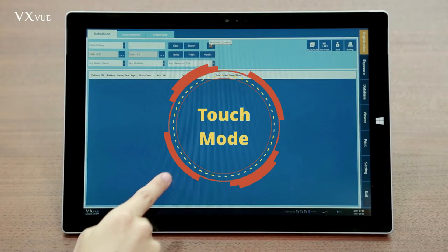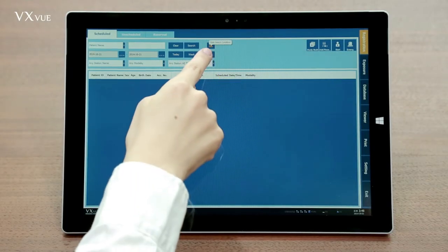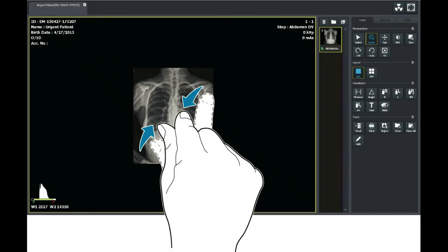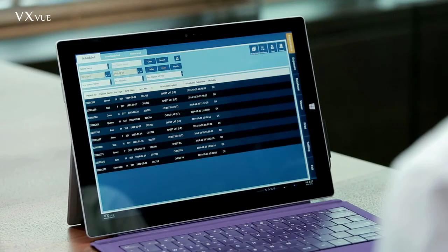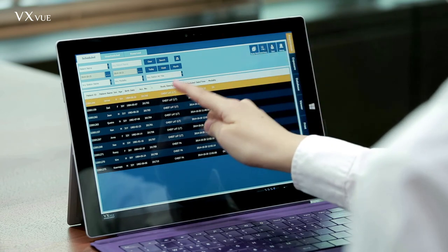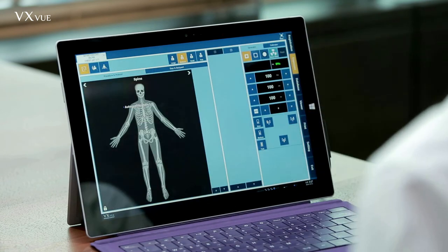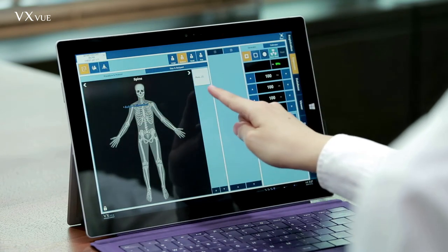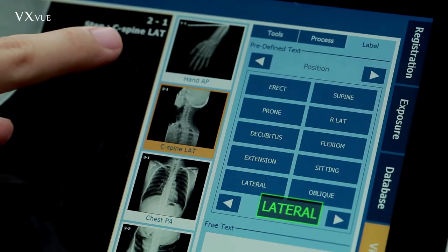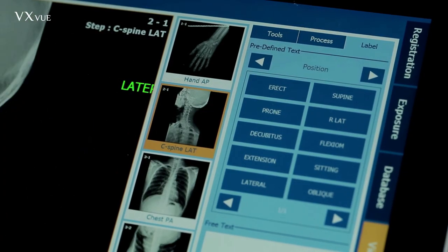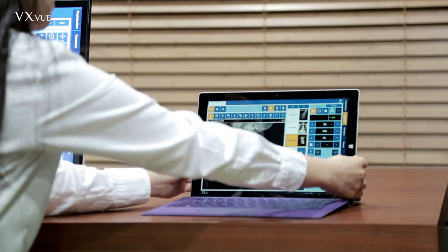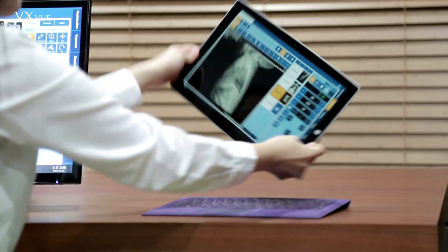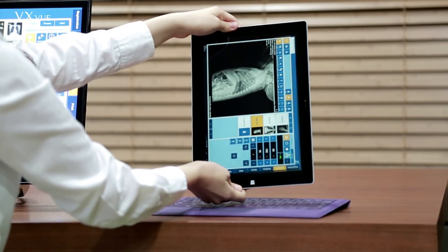Every VXVue mode supports touch function if your device has a touch screen. Like any other touch screens, you can zoom in or out using your fingers. Double tap to go to full view and more. VXVue changes the layout of the screen automatically when the screen is rotated.